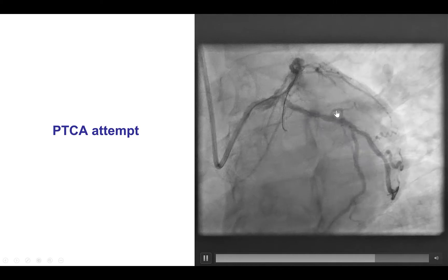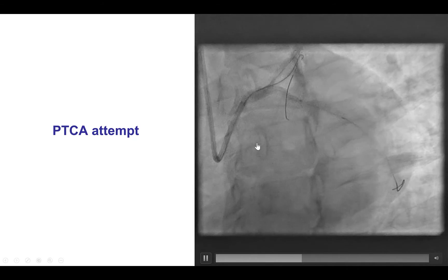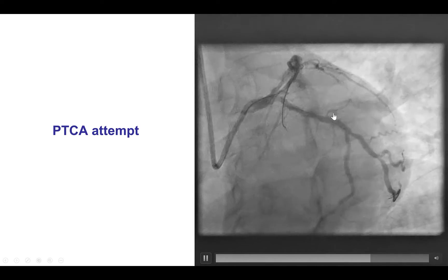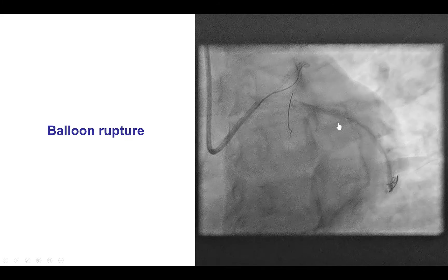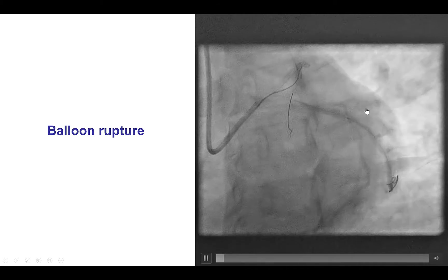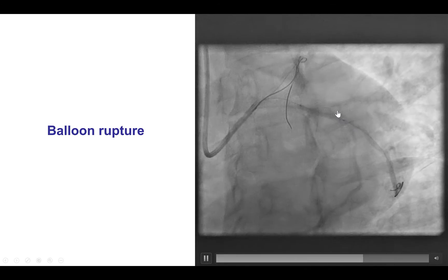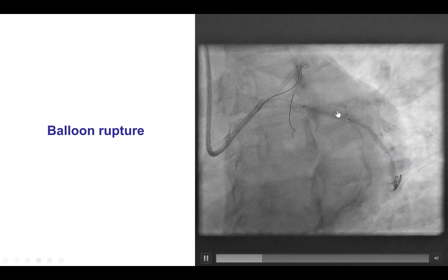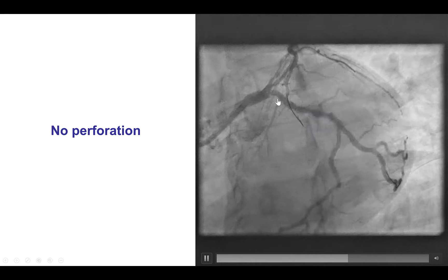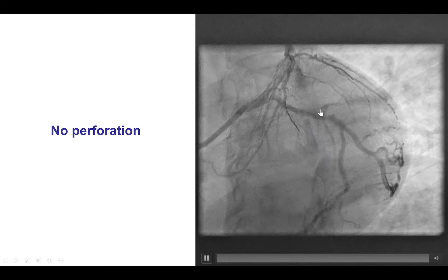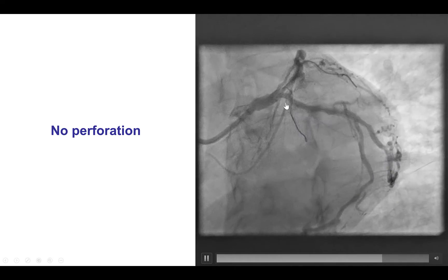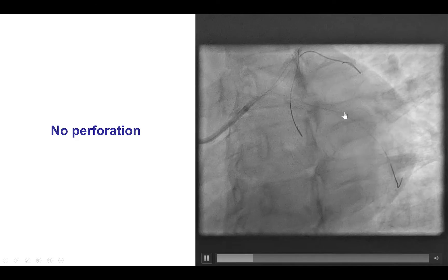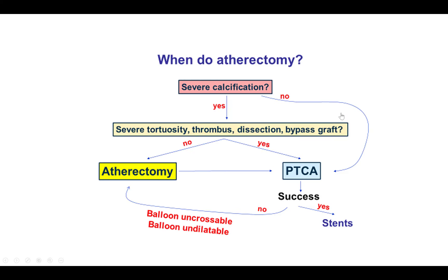We wired the circumflex as well as the LAD and the diagonal branch. We performed balloon inflation in the circumflex, however there was rupture of the balloon. After rupture, we confirmed there was no perforation by angiography. However, after this we decided to proceed with modification of the lesion with atherectomy.